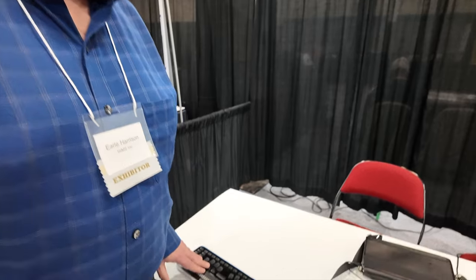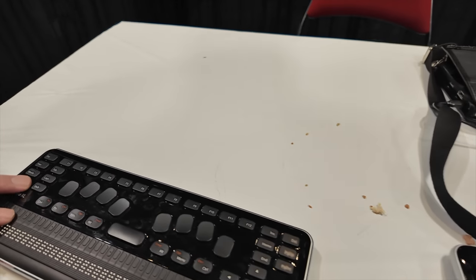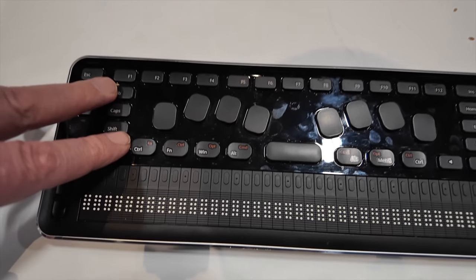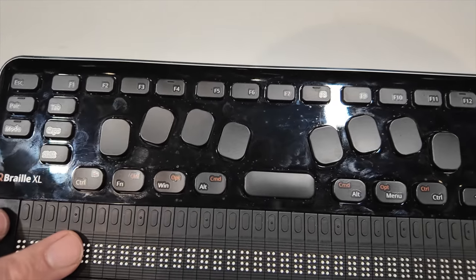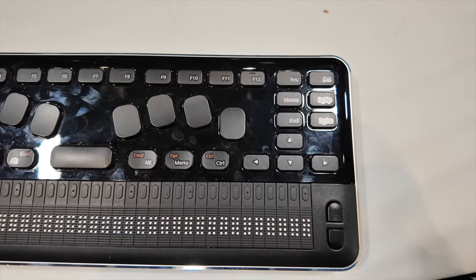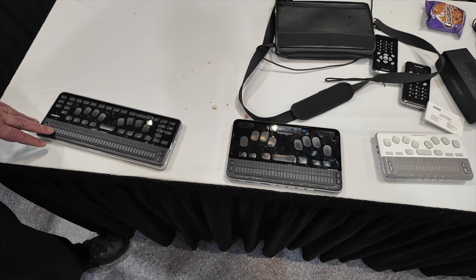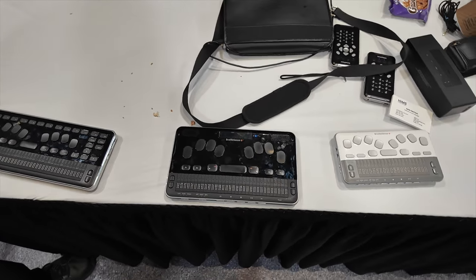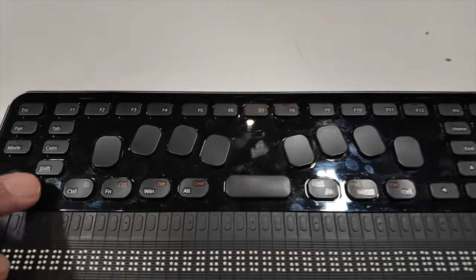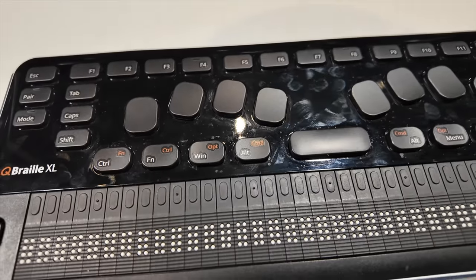This one here, instead of being, quote unquote, a note taker like these are considered, is a Braille display. It's a 40-cell Braille display that can connect to up to 7 devices simultaneously on the fly. Although it has some internal functions like taking notes and a calculator, its main function is to connect to other things, like iPads and computers. Sort of a centralized remote control. Well, except it's got a keyboard on it.